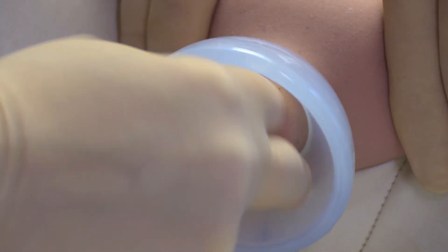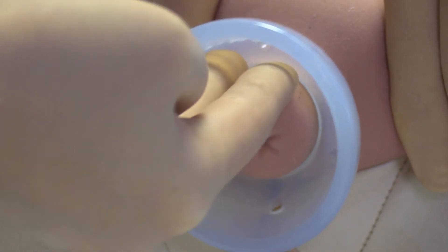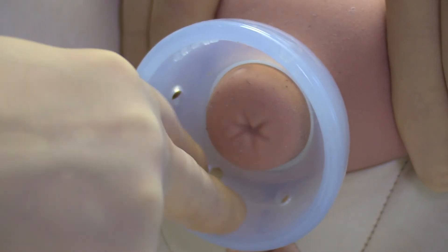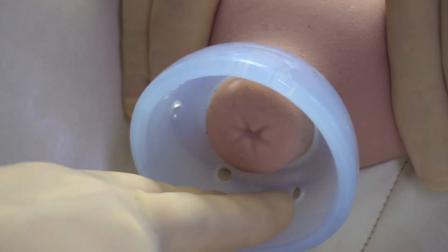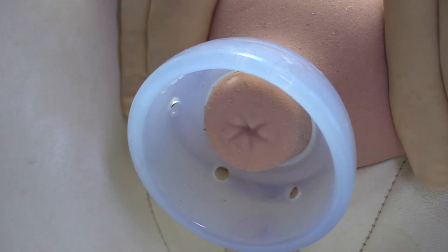If the cervix is not centrally positioned, then the fingers are used to align the pessary correctly around the cervix. The posterior part of the pessary is then pressed slightly upwards towards the sacrum.